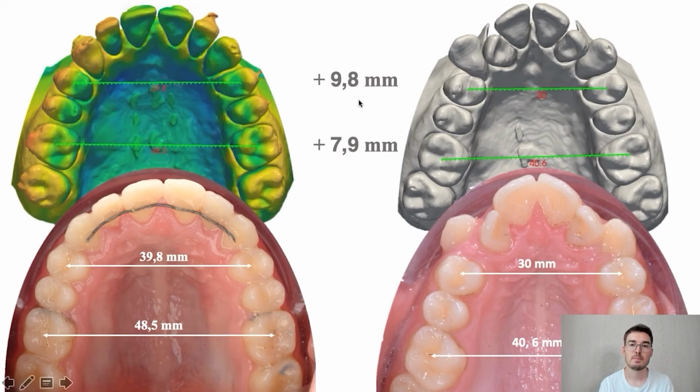The general change in the teeth is plus 10 millimeters. It means that we got 7 millimeters of skeletal width and 3 millimeters of extension at the level of the teeth. Look at the amazing shape we've got. It is very wide. Yes, it is slightly smaller than we wanted around the molars, but in the area of the premolars, the expansion is bigger. It makes sense because the device itself and the microimplant were located closer to the anterior section, so the width in the anterior section is more pronounced when we use this configuration of the device.